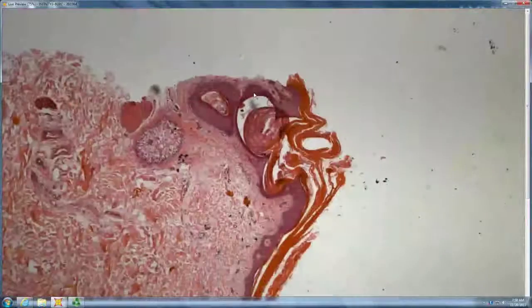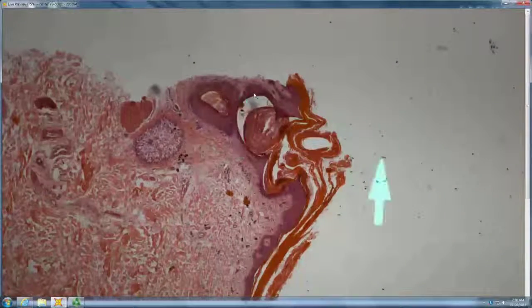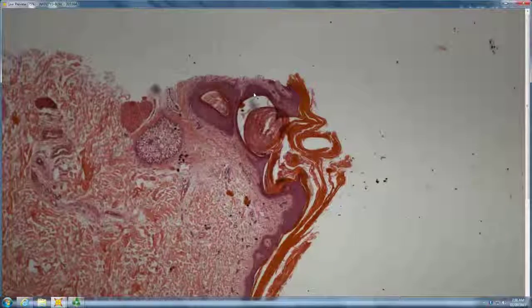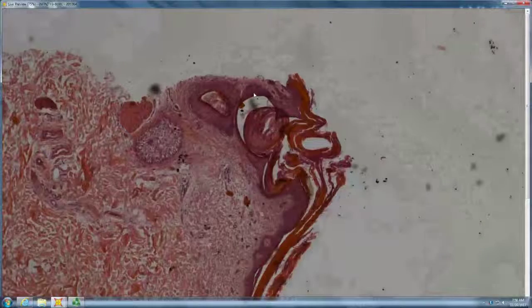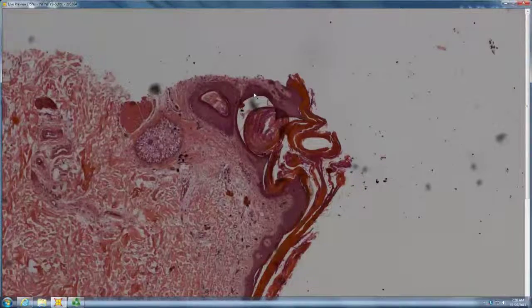And then, how about this on the side? Looks like a plugged follicle. So what do you get associated with ichthyosis vulgaris? KP. Yeah, because they're often atopic and they get keratosis pilaris, so that's a very, very common association.